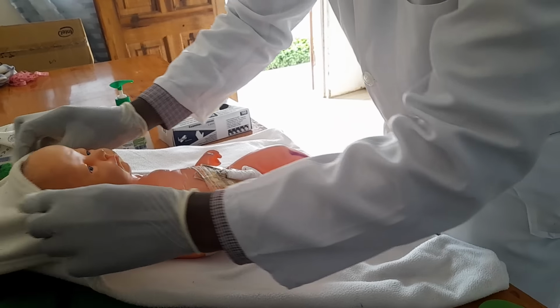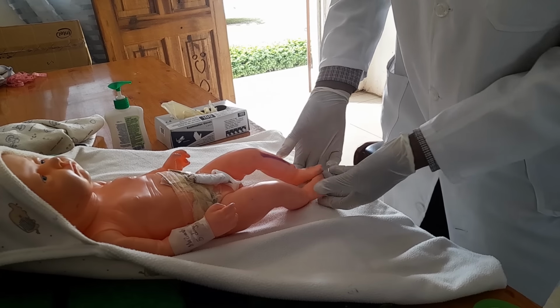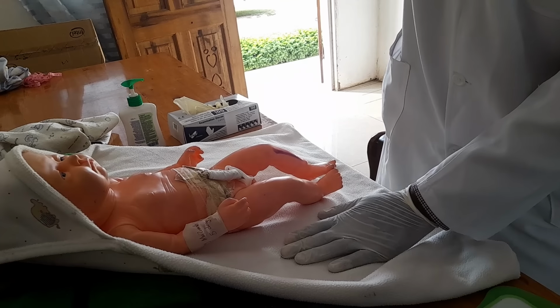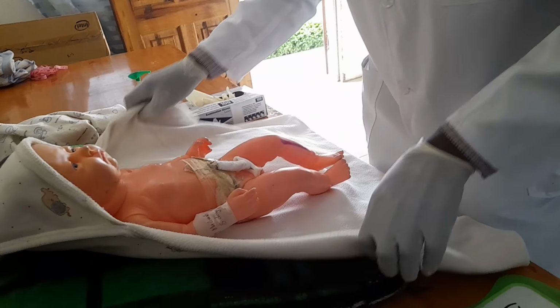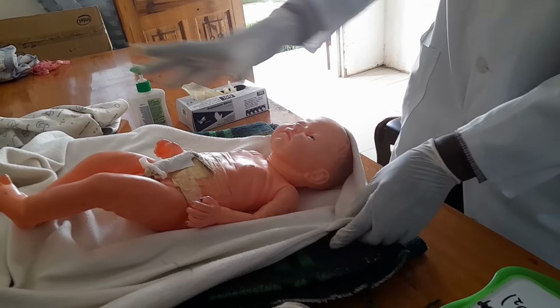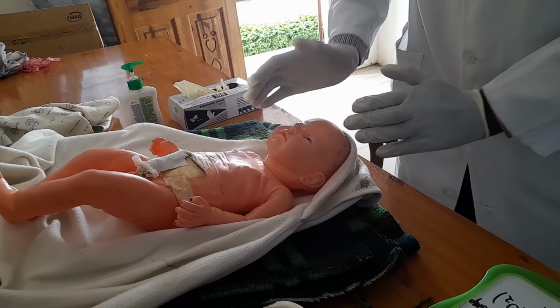Then leave the baby in this receiver. Then cover its head. Sometimes if you've got socks, you can put socks on to prevent hypothermia. But at least the resuscitator is on, it's radiating some heat on the baby. So at this moment, you're going to turn the baby like that. Once you turn this baby, it will be in a slanted position, or we call it a neutral position, in this manner.